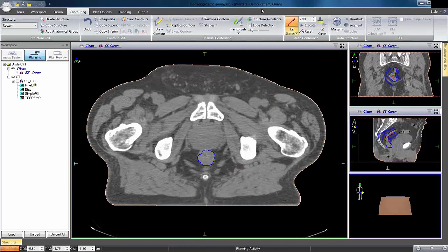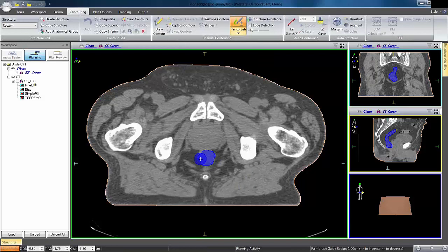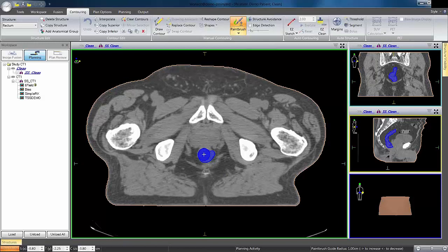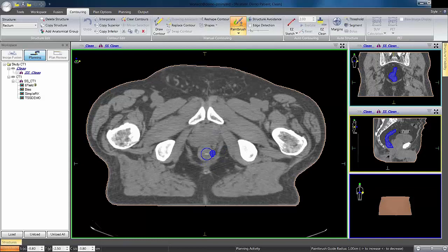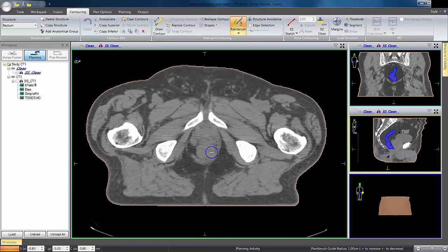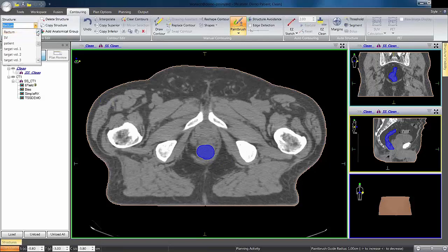I know I need to clean up down here a little bit, so I'll switch over to my paintbrush. The plus allows me to add to the contour; if I bring the minus up, I can clean it up that way. So now we have a rectum structure we can use as part of our plan.